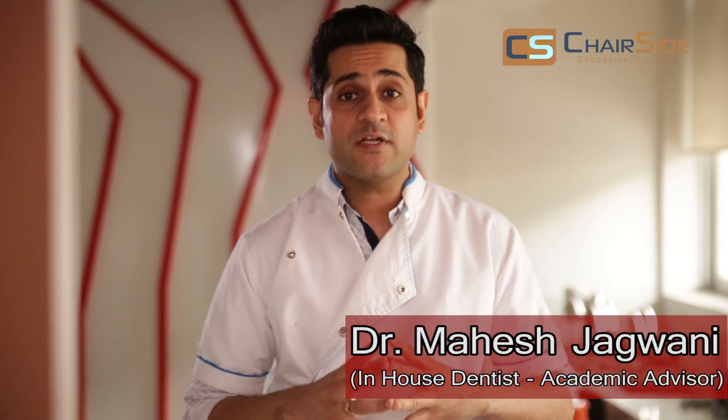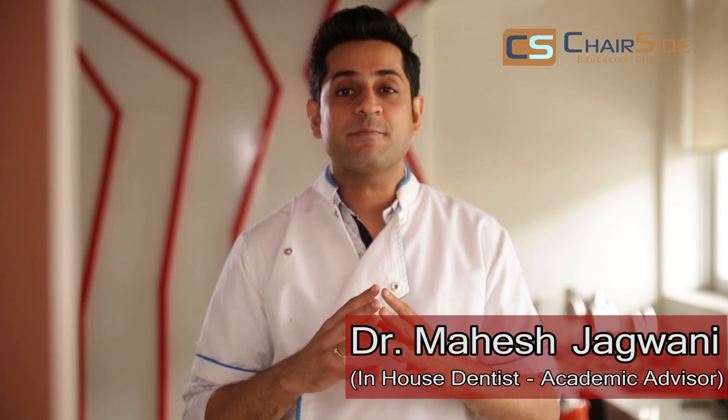Hello dear viewers, today's video is going to be about implant level digital impressions using the 3Shape Trios 3 intraoral scanner. You all must have seen one of the previous videos on a single unit implant level scan, but this time it's going to be even bigger with 4 Biodenta implants in the lower arch. So let's quickly move chairside where everything is set up and the patient is ready to be scanned.